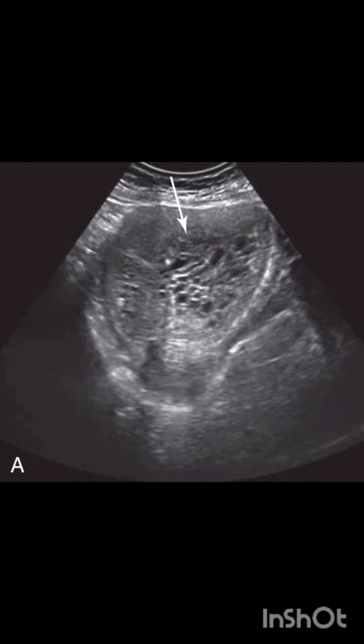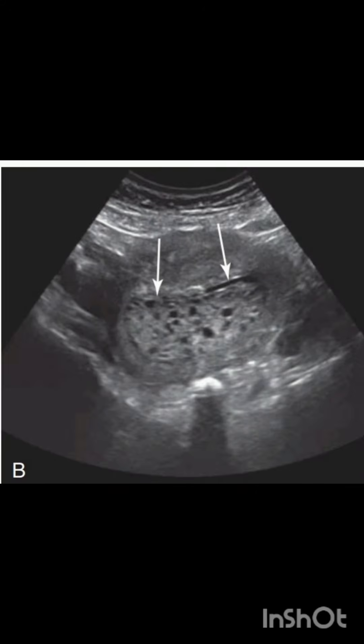Now let's look at classic ultrasound findings of a complete hydatiform mole. As you can see here, the ultrasound reveals a heterogeneous echogenic mass with multiple small cystic spaces. This is often described as a snowstorm or bunch of grapes appearance, due to the hydropic degeneration of chorionic villi. Unlike a normal pregnancy, a complete mole has no identifiable fetal tissue.